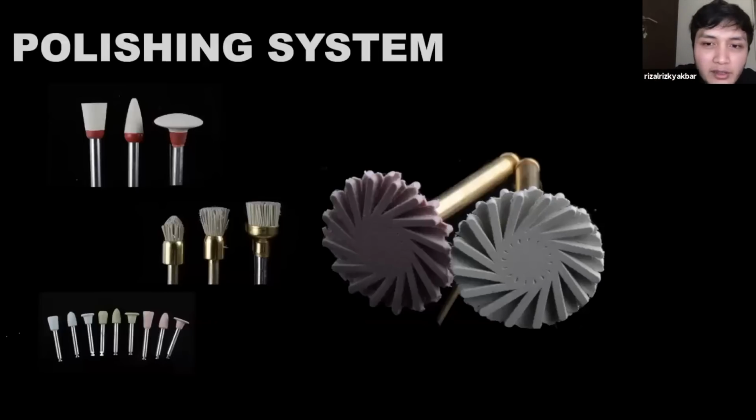How about the polishing system? There are so many polishing systems in the market now. But let me tell you something. There's an innovative brand that really changed my dentistry because it's really simple. The brand and the tool is Dialite. As you can see in the right picture, Dialite is really easy to use and also cheap, I think.